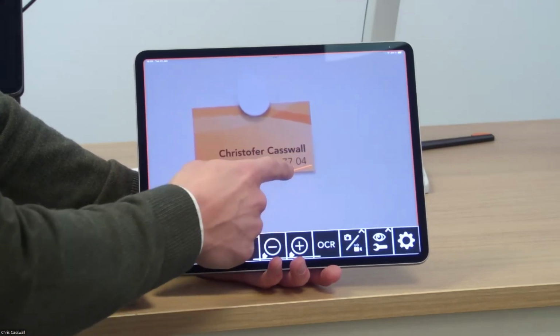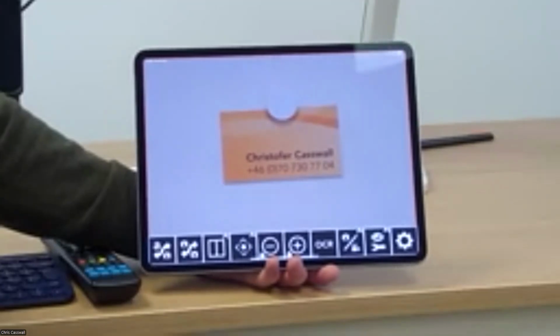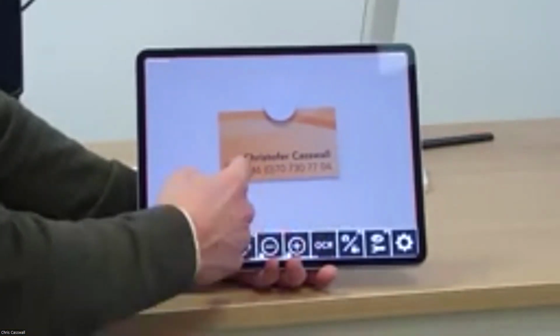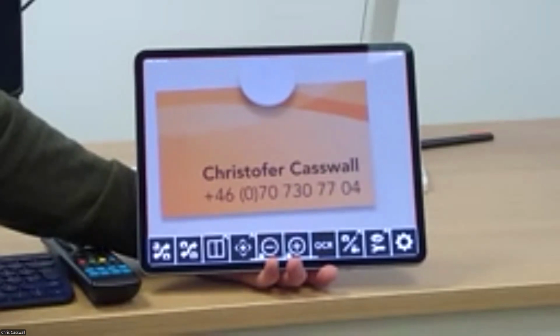That makes it quite easy for someone in a distance situation to smoothly move or find what they are searching for, instead of doing that manually with their hand, grabbing a camera and trying in high magnification to find what they're looking for. Some say this is smoother and easier. So I'll give this a little more magnification. And that's my business card that I have placed on this whiteboard 29 feet away.